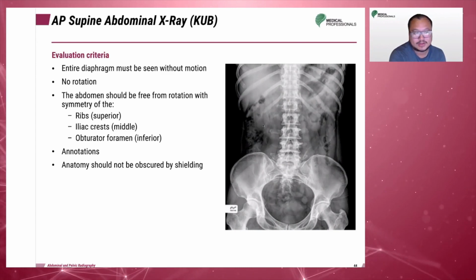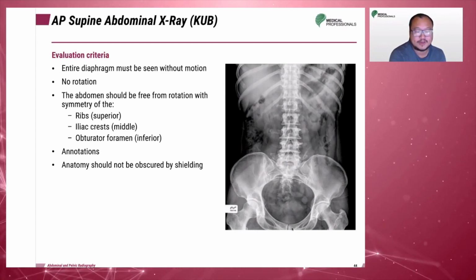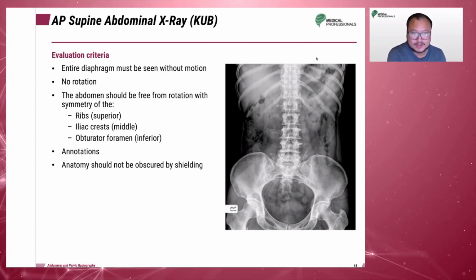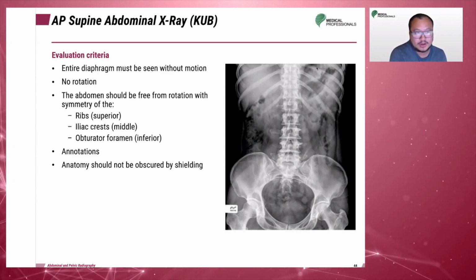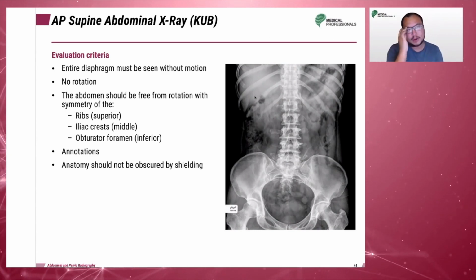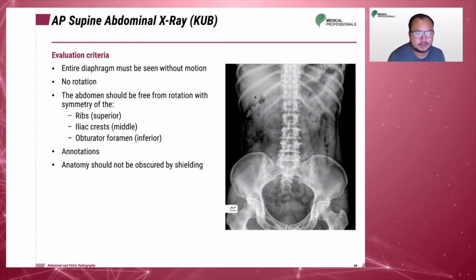So if you see the kidneys, you're good, as long as you include the symphysis. I've been to some places where you have to include the diaphragm and the symphysis. I've been to some places that do a lengthwise lower portion, a crosswise upper portion. So it all varies dependent on the facility you're at on how they want these x-rays positioned. Okay.